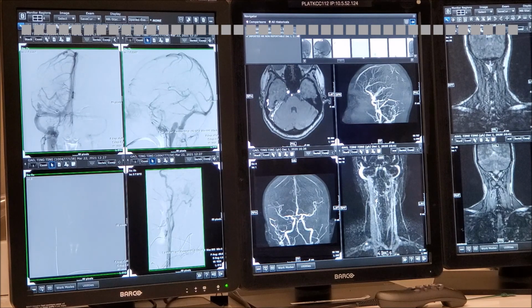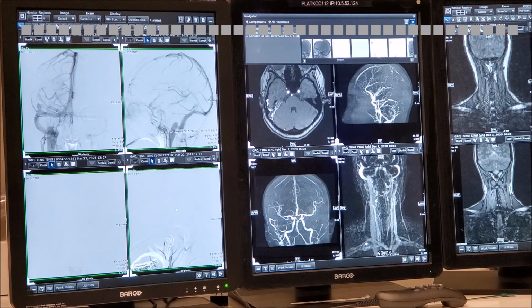I'm going to leave that there because I don't know what this one is. There are sometimes, when you're doing the workup of dural fistulas, that if I see this, I may change, instead of diluted 50% contrast, I would like to put pure contrast because of the dilution effect. You will get a better opacification.